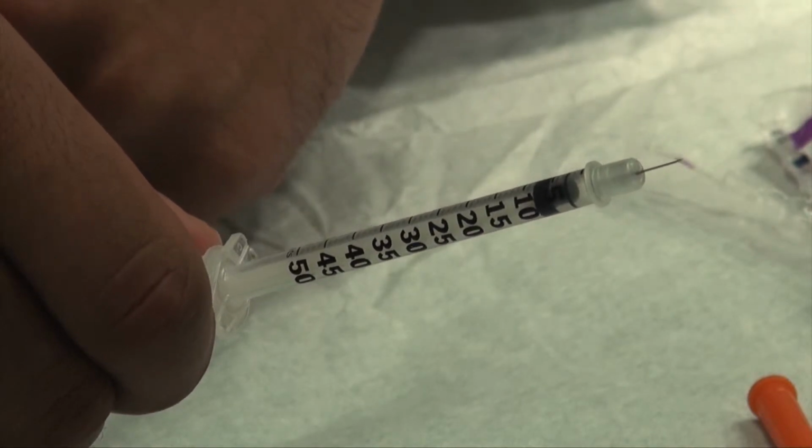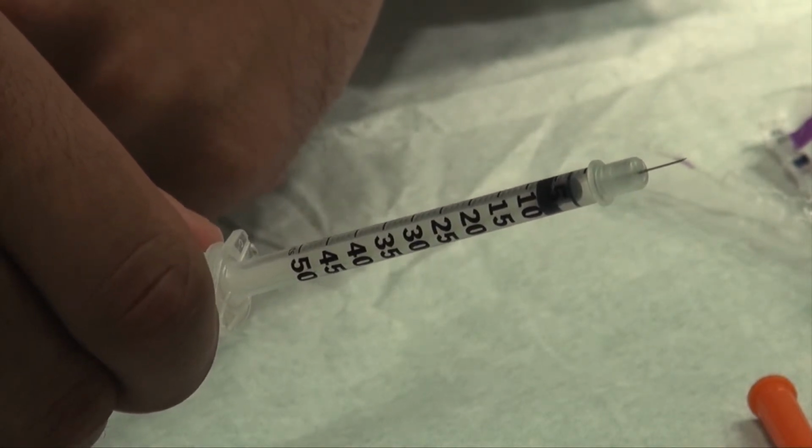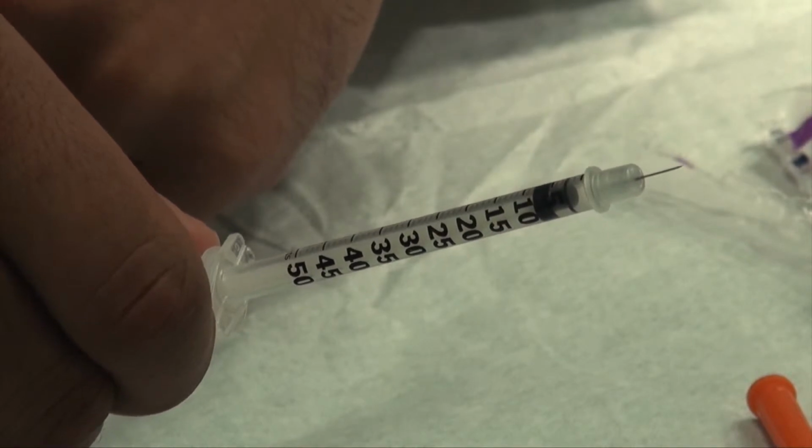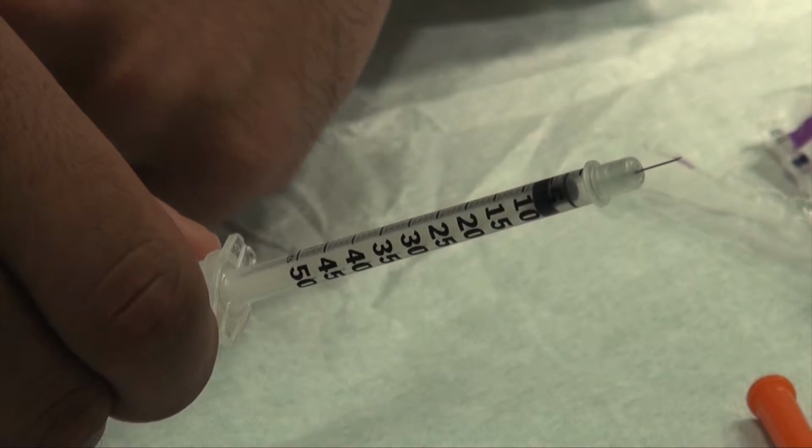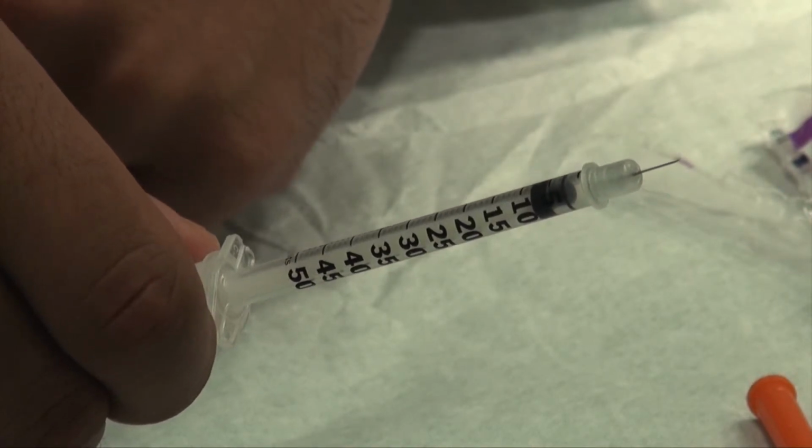The calibration is the same as the other 0.5 ml needle, so in terms of measurement of your dosing, it doesn't change, but it's a more accurate tool and a safer tool to work around delicate areas such as the crow's feet.